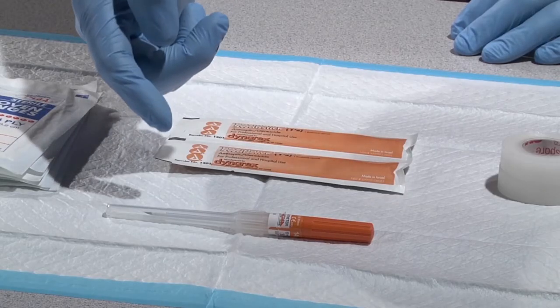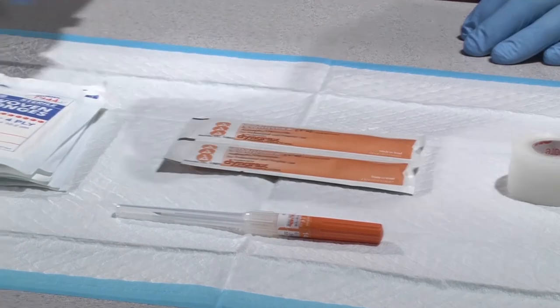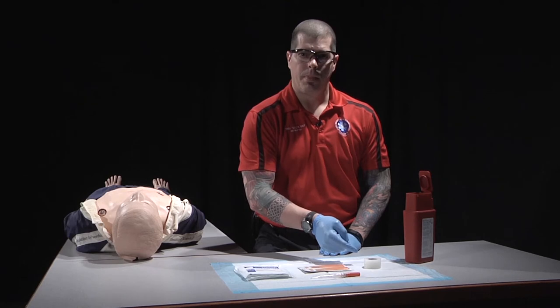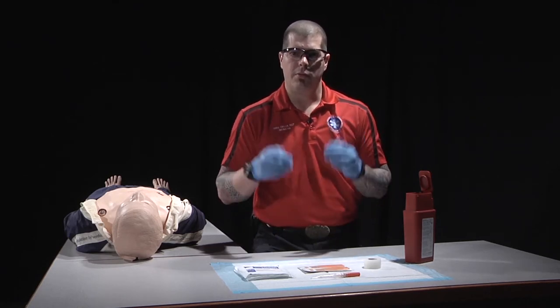For this skill, it's a 14 to 16 gauge needle, iodine or alcohol solution, 4x4s, tape, a sharps container, and PPE, which for this skill is gloves and eye protection.